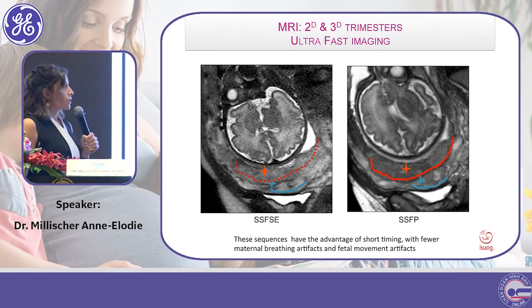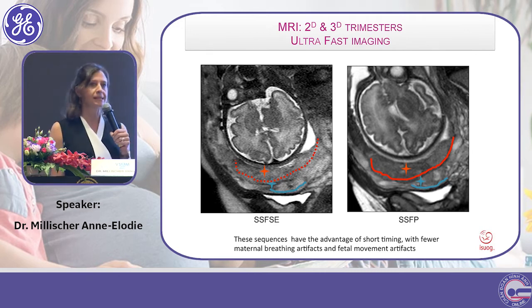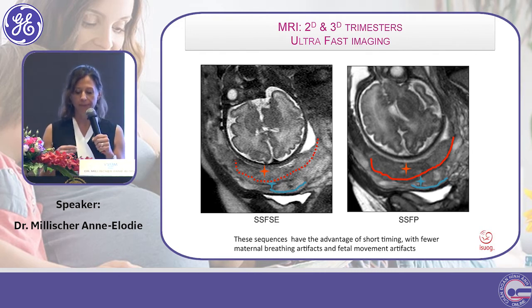The recent literature offered some kind of guidelines to correctly assess a placenta during your daily scanning.